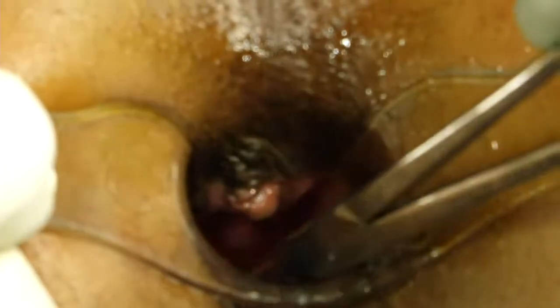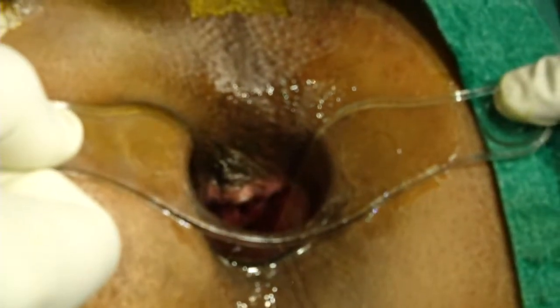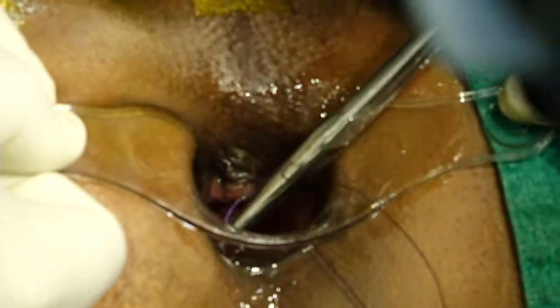Show it a little. Okay, the vertical columns of Morgagni, and taking a bite, crossing over it, and taking the half, that's fine, sir. Three and four mm penetrations, and a figure of eight. Actually I am taking this figure of eight. You can use the Doppler too for assessing and targeting the vessels.